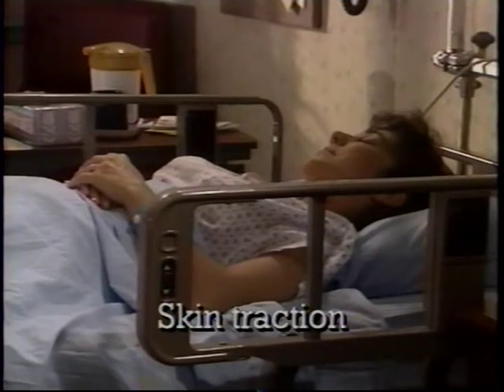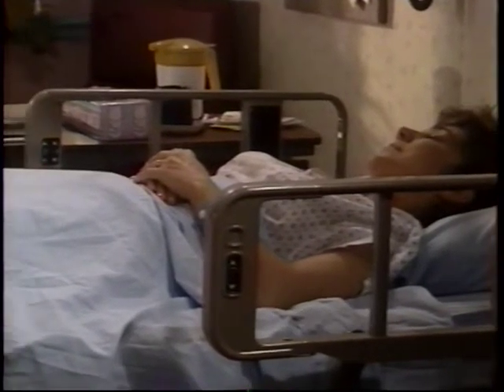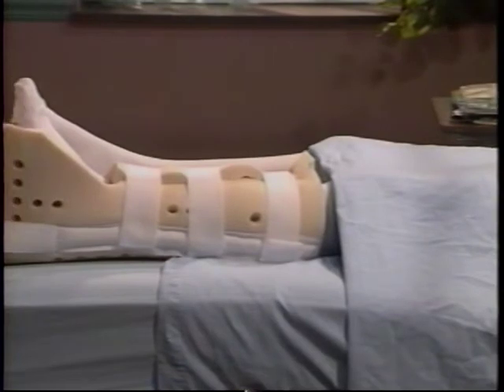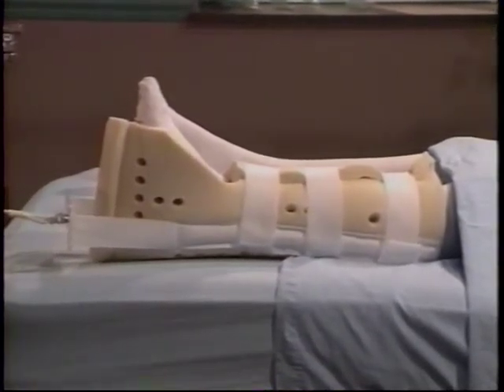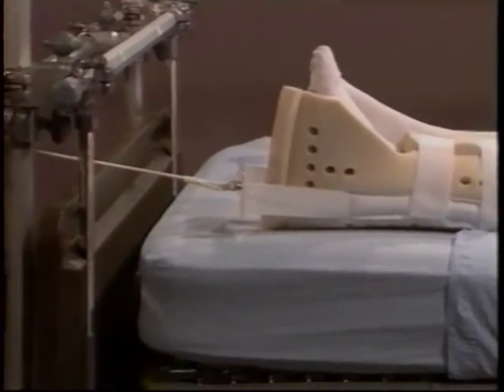Skin traction involves the application of a pulling force directly to the skin through the use of adhesive traction tape or non-adhesive devices such as belts, halters, or boots. It is used on a short-term basis, usually less than 2 weeks. It is often used as a temporary measure prior to more definitive treatment, such as surgery. A light pull of 5 to 8 pounds is used.